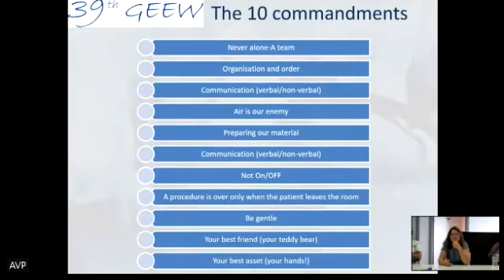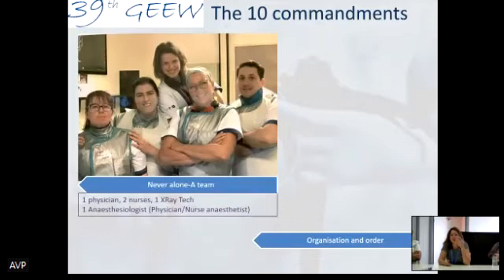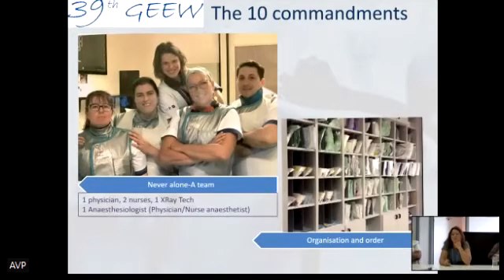Be gentle. You always have your teddy bear with you, and you will see which one that is. And your best asset is your hands. So always team, it's a teamwork ERCP, and that's why it's very important to train your doctors to show you the images, tell you what they're going to do, and to work in a team. We are quite lucky to have a good team, and we also have an anesthesiologist. We also have a technician for X-ray, and so these are the best conditions possible to work.